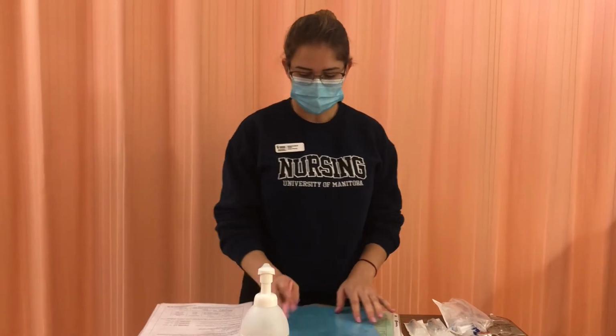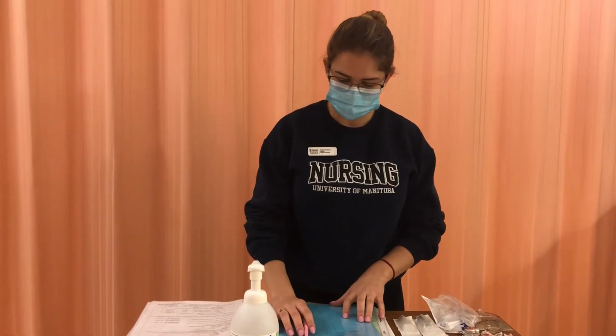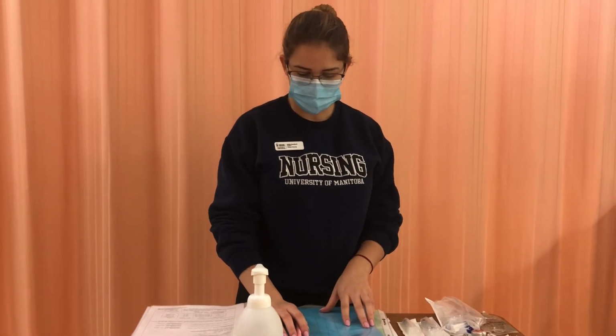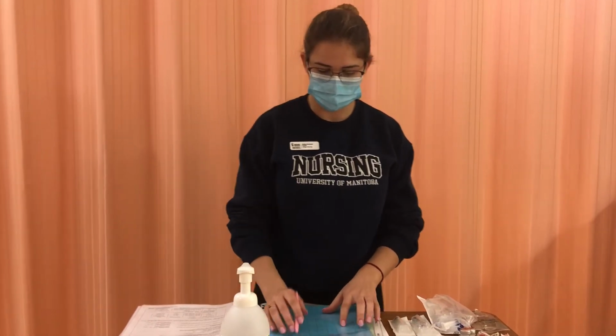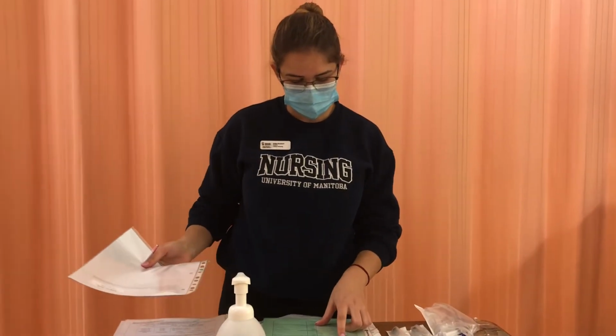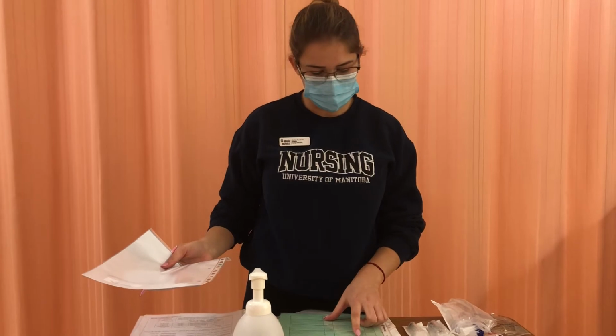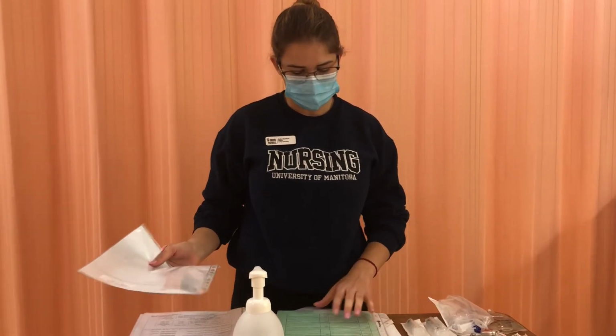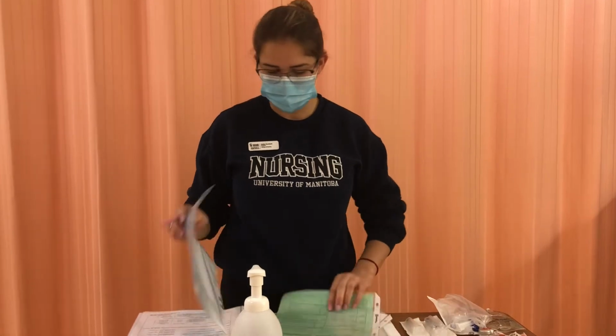So I'm just going to go over my patient information. I have Emma Wrightson. Her FIN is 123456789. Her date of birth is the 20th of October 1990, and her doctor is Dr. Nichols. She has no known allergies, and I'll be checking to make sure that the MAR has been checked and transcribed by 2 different nurses, and it has. Okay, so I'm just checking on my physician's orders that I have a primary infusion of normal saline running at 25 cc's per hour, so I'll make sure when I go to the bedside to check for that rate.